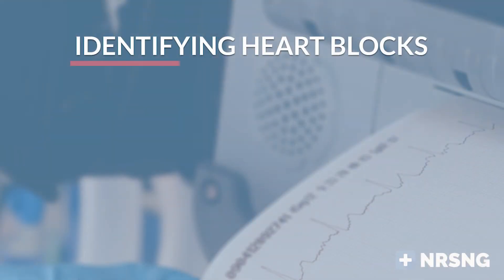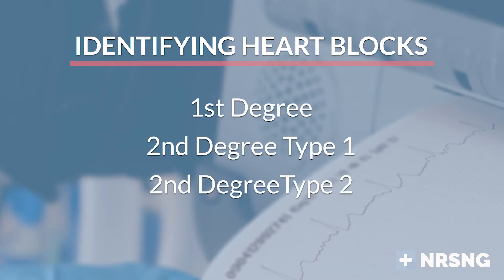I've been a nurse for over a decade as a telemetry and a medical surgical nurse, and today I'm going to give you some quick tips to identify first degree, second degree type 1, second degree type 2, and third degree heart blocks.